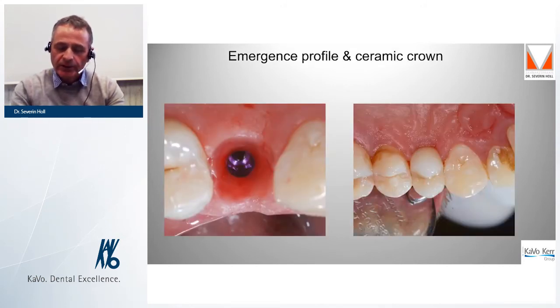After the healing period, we have a very beautiful emergence profile. Furthermore, on the right side, you can see the definitive ceramic crown.